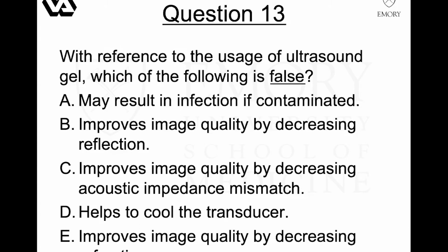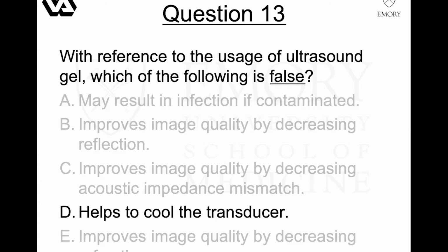Yes, good job. It does not help to cool the transducer. That is false. So there have been infections reported from contaminated ultrasound gel. Actually, surprisingly, believe it or not, it was not for transthoracic, it was for TEE. So in general, if you try to do TEE, be aware that the bottle may be contaminated. That can be an issue sometimes.